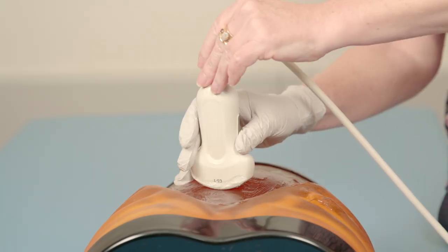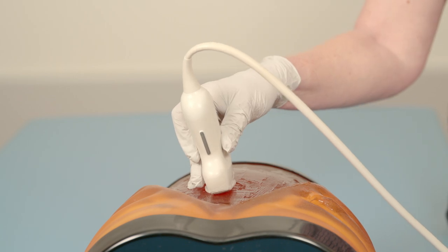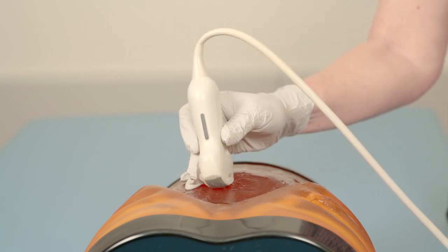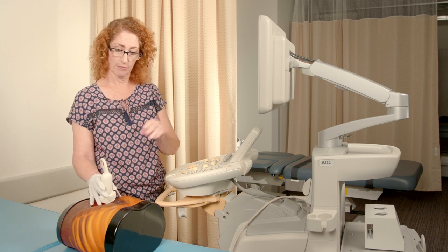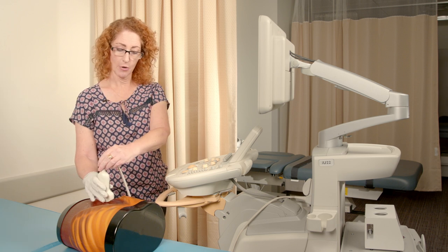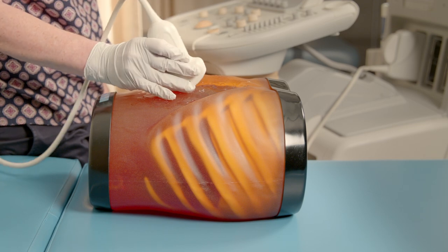Rocking is performed by rocking on the face of the transducer. This can be done in any direction — rocking transversely and rocking longitudinally.